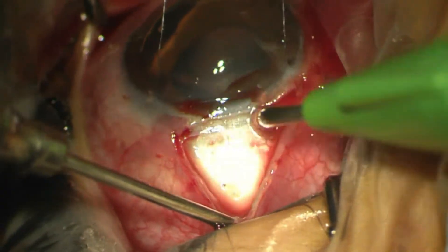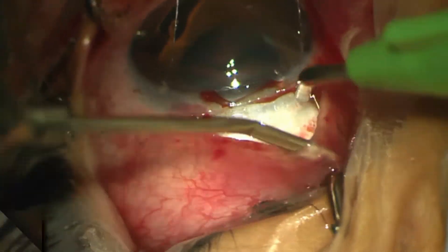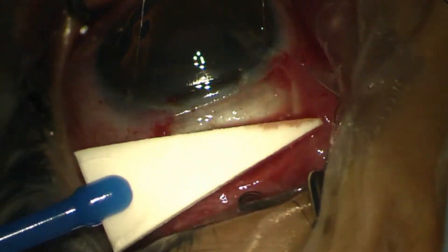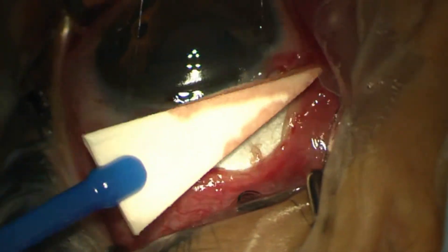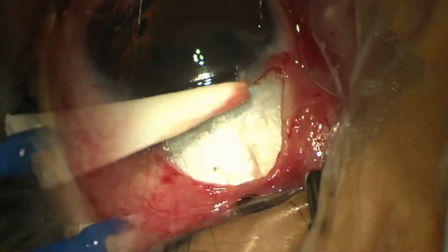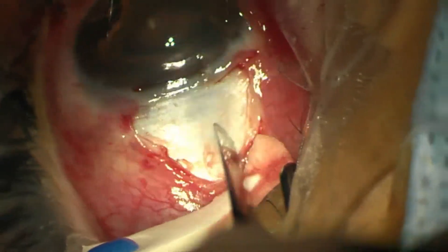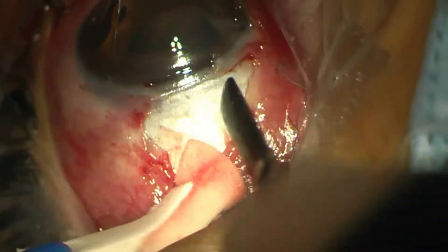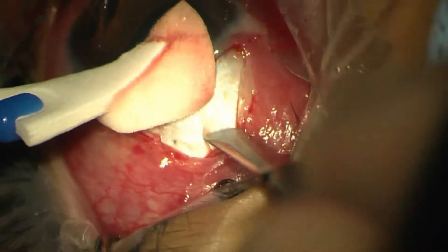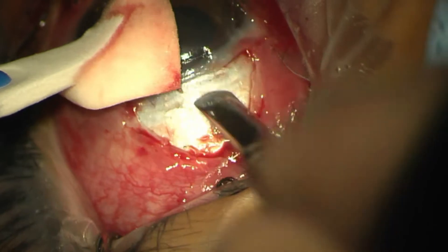After peritomy, good hemostasis, and debridement, we started to fashion the superficial flap, approximately four by five millimeters.